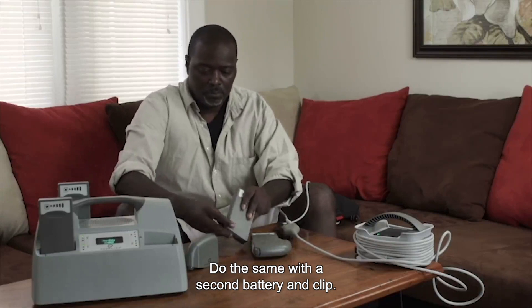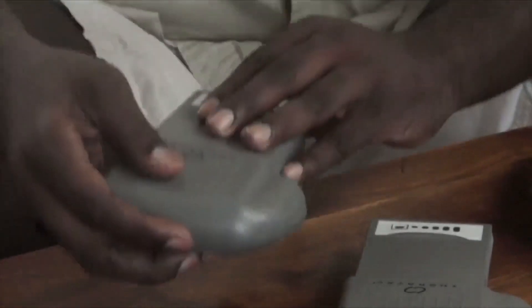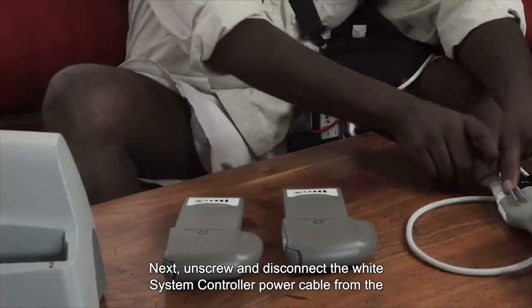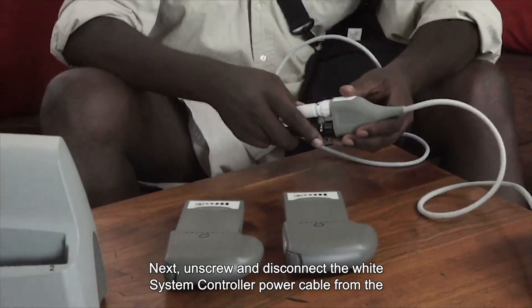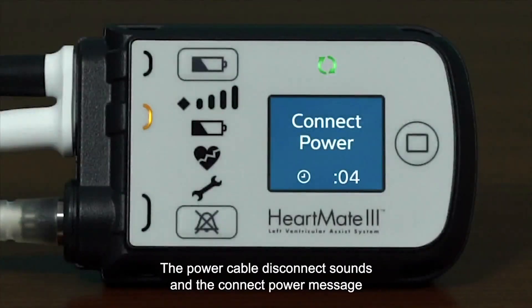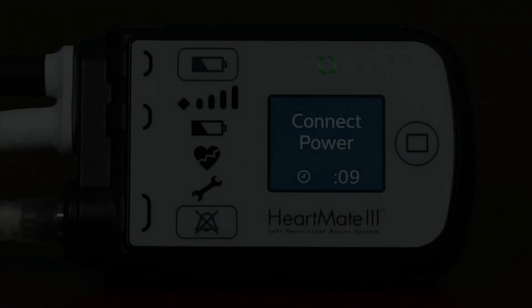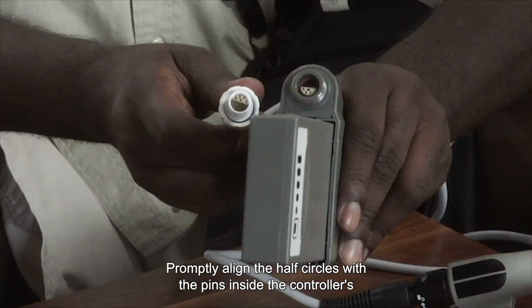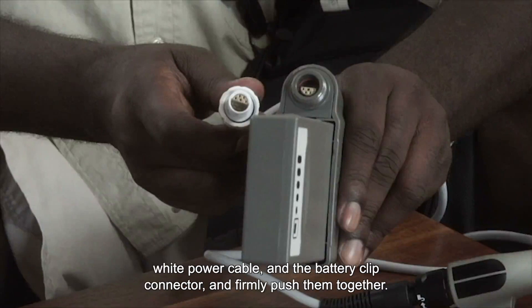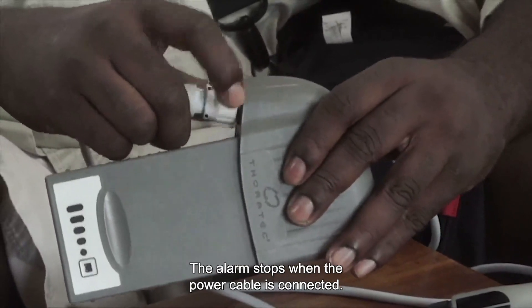Gently pull back on the battery to make sure it is locked in place. Do the same with a second battery and clip. Next, unscrew and disconnect the white system controller power cable from the white mobile power unit patient cable. The power cable disconnect alarm sounds and the connect power message displays on the screen, which is normal. Promptly align the half circles with the pins inside the controller's white power cable and the battery clip connector, and firmly push them together, hand tightening until it's secure. The alarm stops when the power cable is connected.